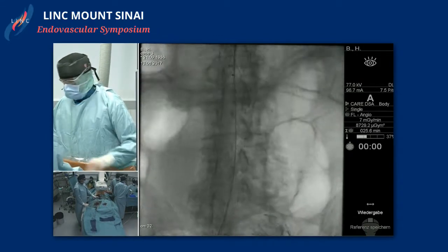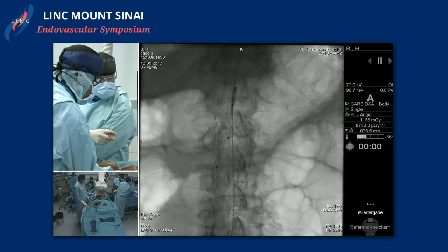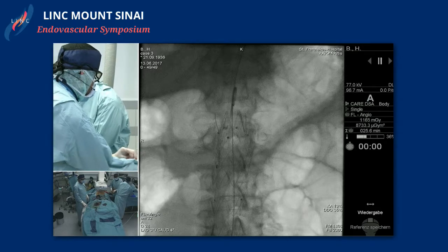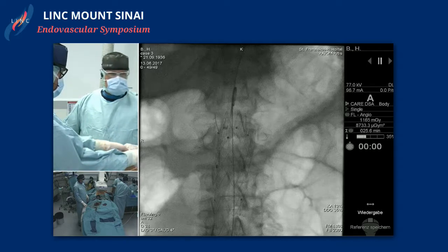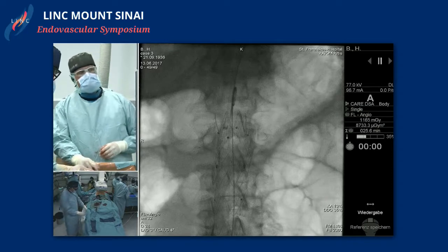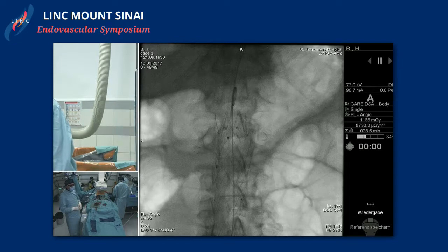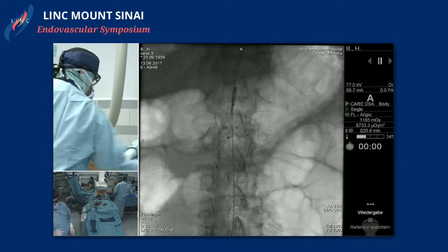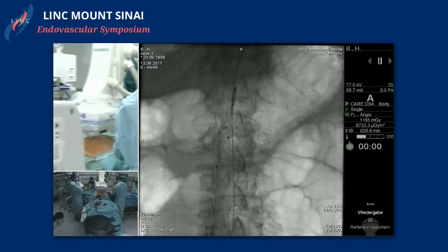Well, thank you. That was a very interesting, very well constructed reconstruction to be able to salvage this situation. If you like, and if we have time, this morning we did a second chimney case, and if you like, we can go through all this imaging. It shows very well our technique. The case from this morning, in comparison to this case.